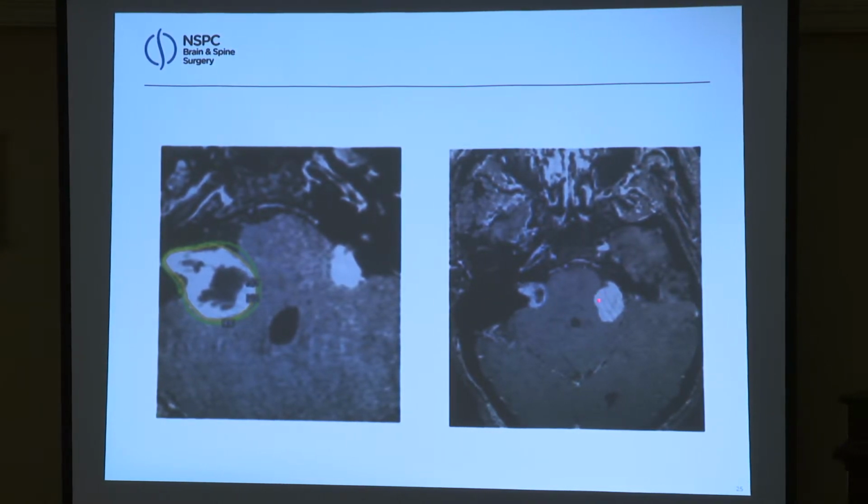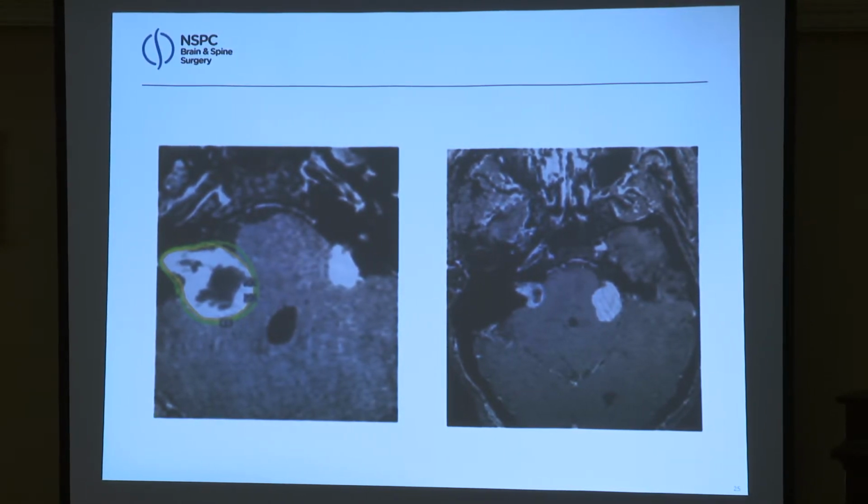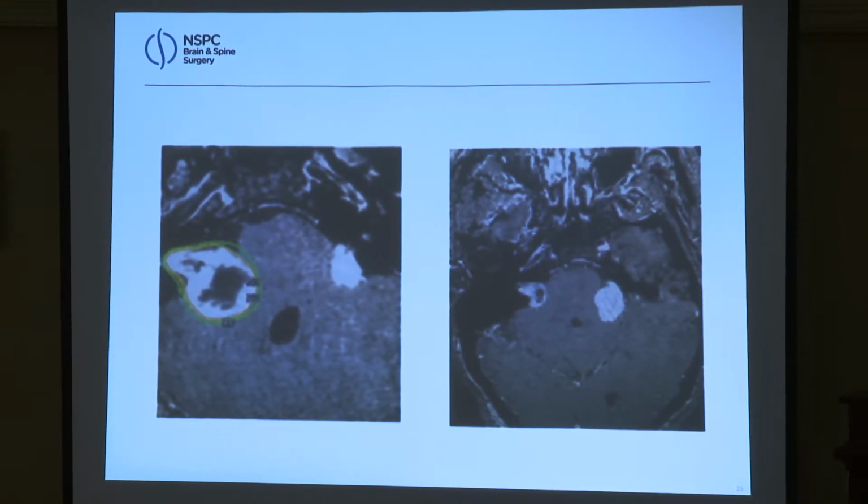Now, this tumor was getting a little bit bigger, and we recently treated the left side tumor, but she did beautifully. And again, I think Gamma Knife and radiosurgery is a beautiful way to treat a lot of people with NF2 who have a lot of tumors. It's pretty morbid, the way it used to be treated, where every single tumor got removed, and this young woman did beautifully.